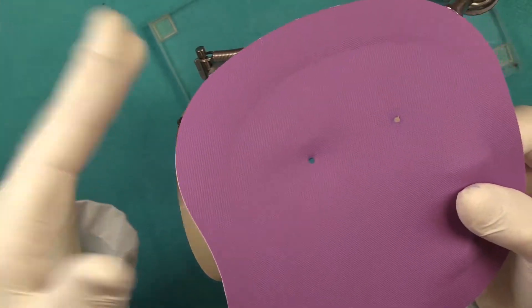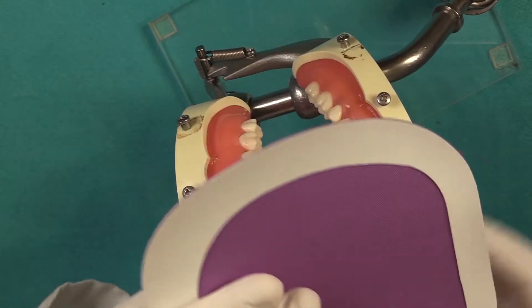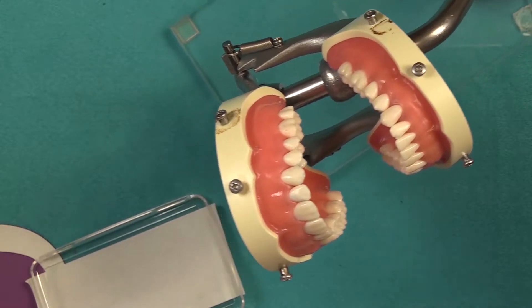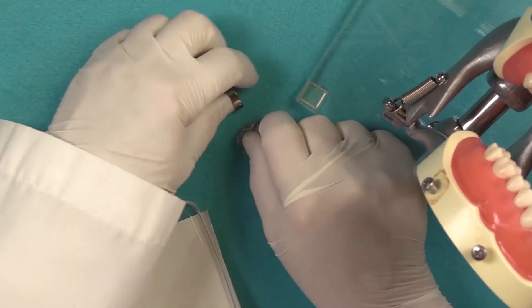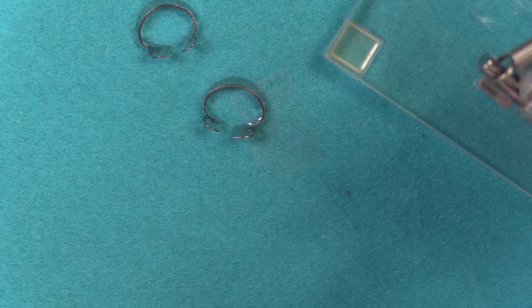If you're doing sealants, you can turn this over and go ahead and place your sealant on the opposite side. For sealants, I would recommend using the Brinker Retractor Clamp — the B2 and B3 is what I normally use. When doing these types of isolations, you want to make sure you either use all wing clamps or all wingless clamps, because the two techniques are a little bit different.